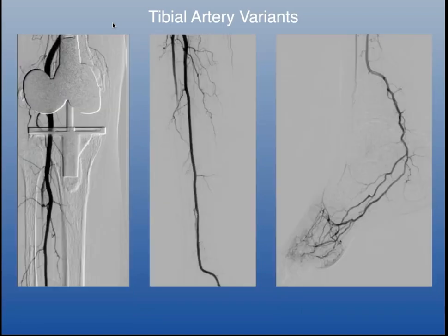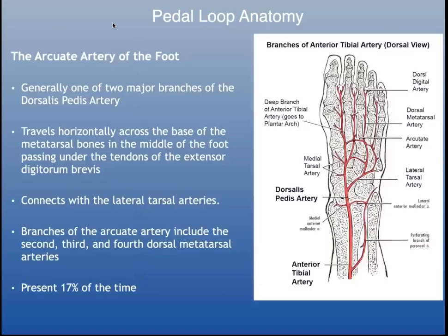And here's another common tibial artery variant, which is the peroneal artery continuous into a posterior tibial artery, and then obviously supplying the pedal plantar loop, which we'll talk about in a few minutes.